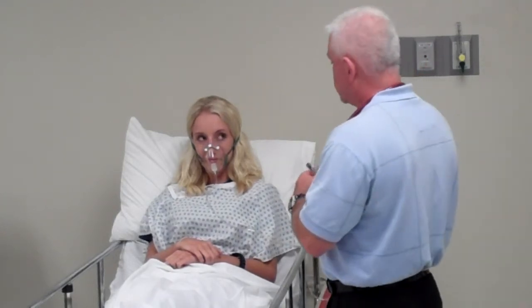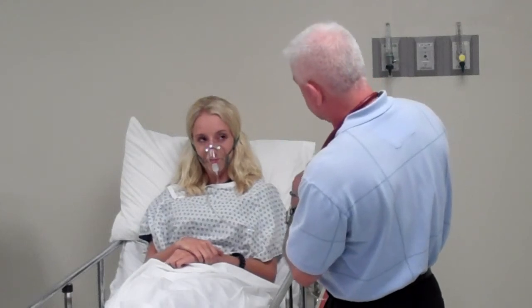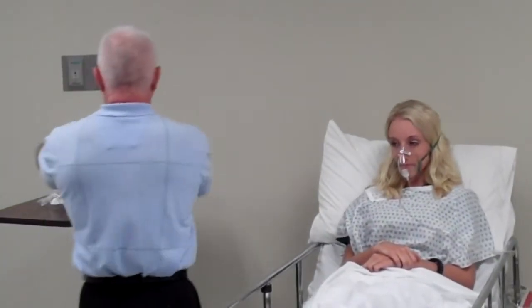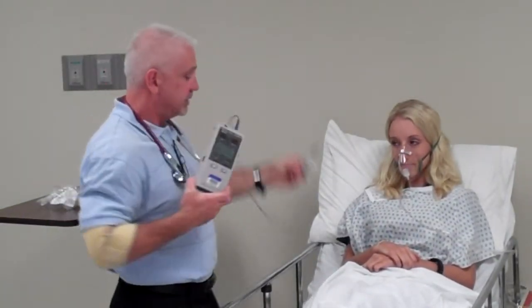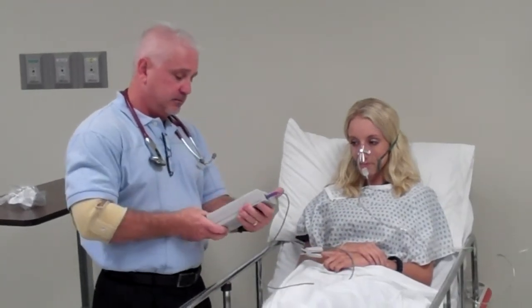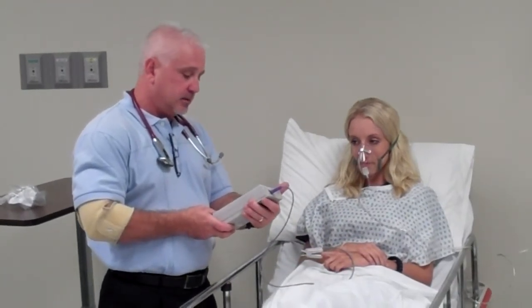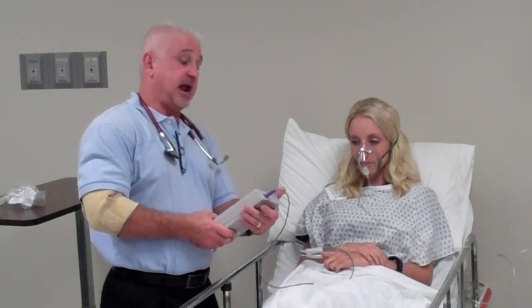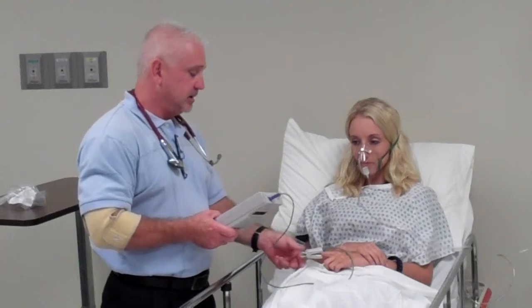And now I would ask Ms. Katie, how do you feel? Okay, feeling pretty good. At this point, I reassess my patient. I check her heart rate, respiratory rate, sat, color, and level of dyspnea. I take the pulse oximeter and check her saturation again. And now her saturation is 95%, which is good.